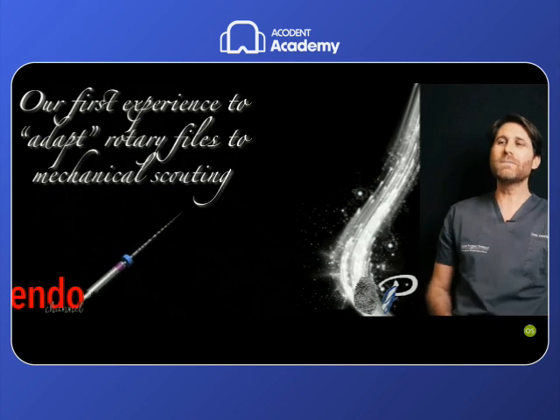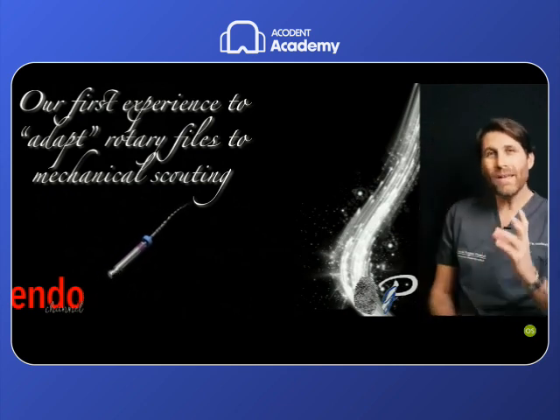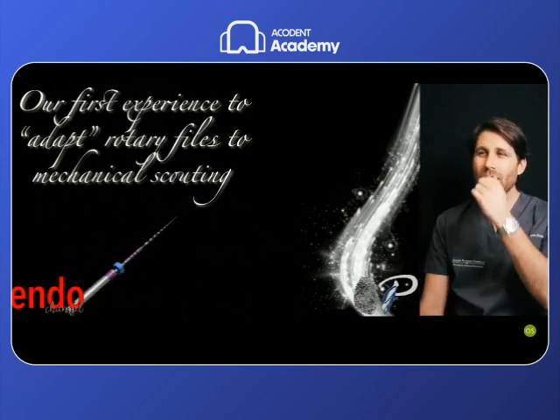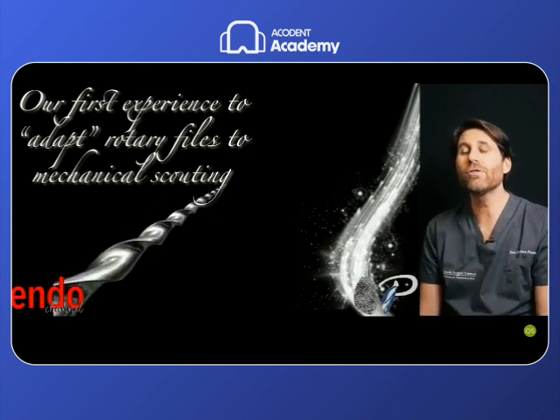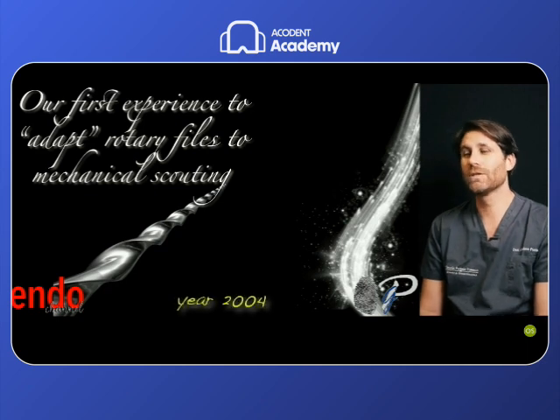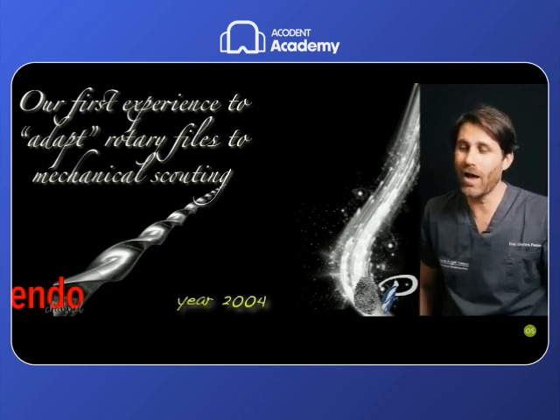So my first experience for doing this strategy and this technique was to adapt rotary files for the mechanical scouting. It was in the early 2000s.